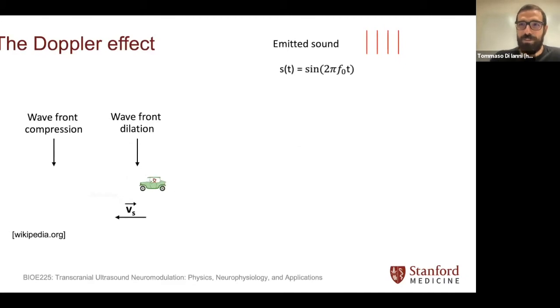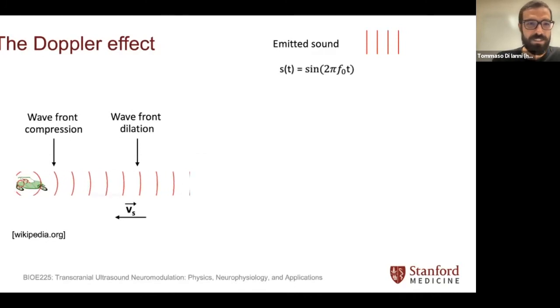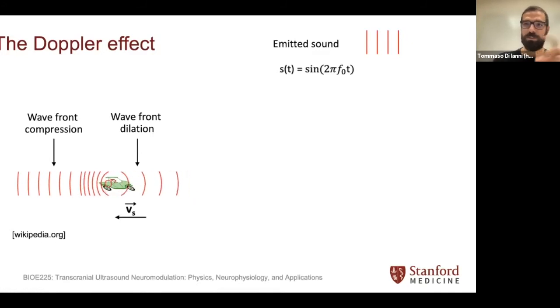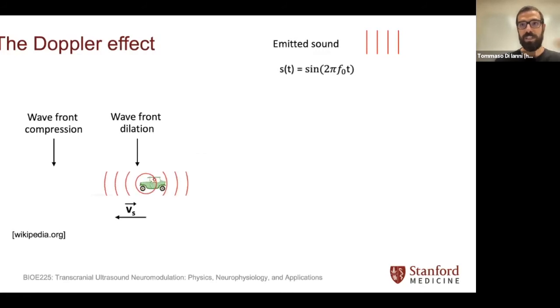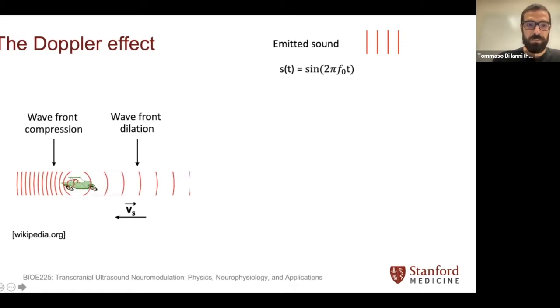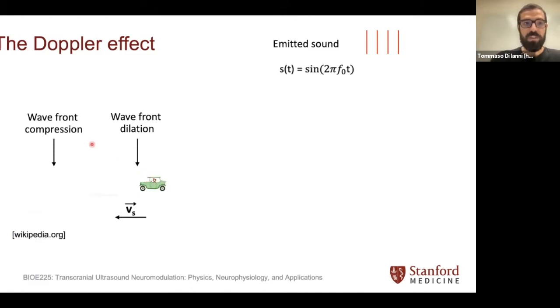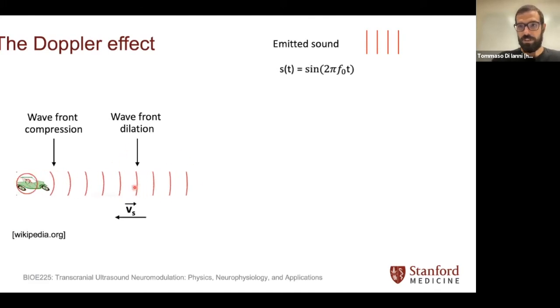So many of you may be familiar already with the Doppler effect. It's very common to experience that shift in pitch when, for example, an ambulance is approaching and then leaving. And so the pitch is increasing and then going down as the ambulance is leaving us. And this is because when the source of the sound is moving, the wavefront is experiencing a compression on one side and a dilation on the other side.